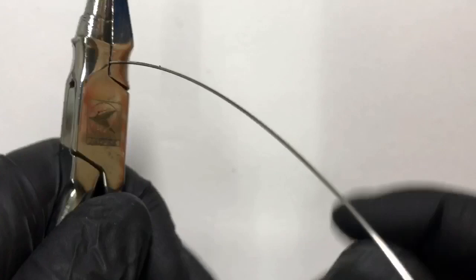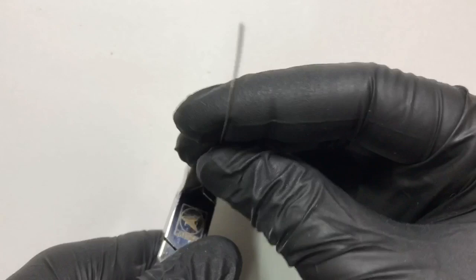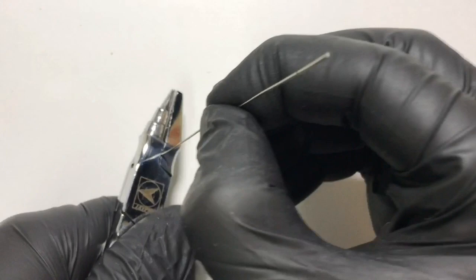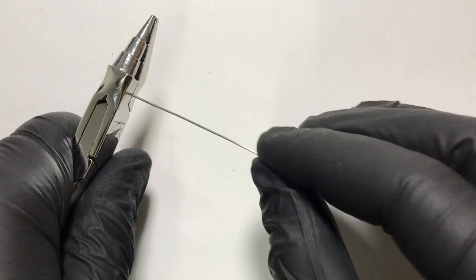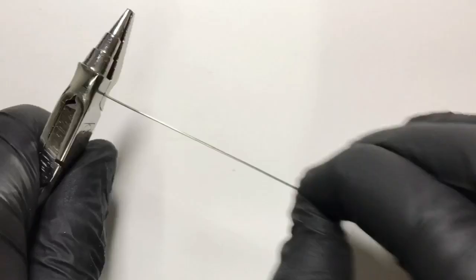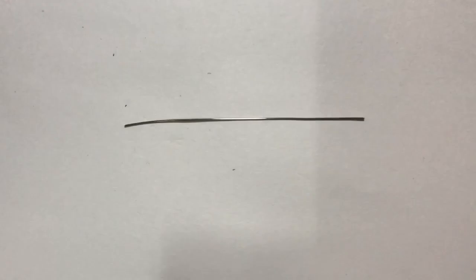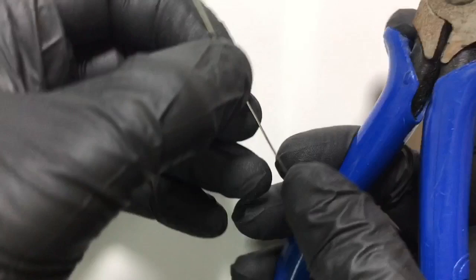In the first step we need to straighten the 23-gauge wire. We will hold one end of this wire in the flat base of the universal plier and with finger and thumb pressure straighten it up. This straightening helps us remove the residual curves or kinks that are present in the wire. Once we are done with straightening, we cut both ends of the wire to get a perfectly straight wire.